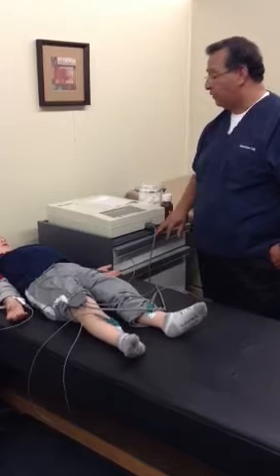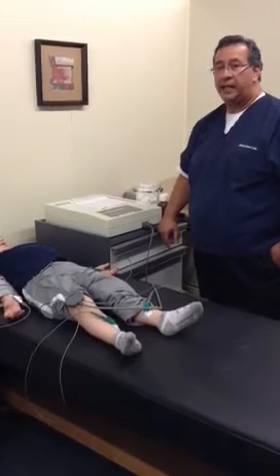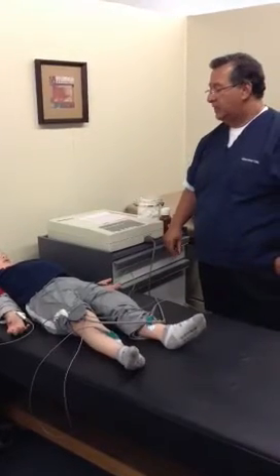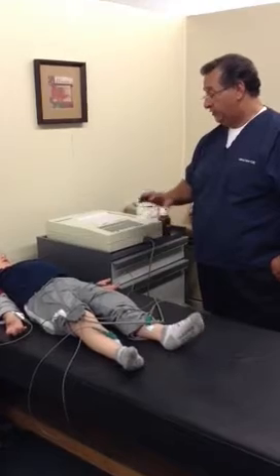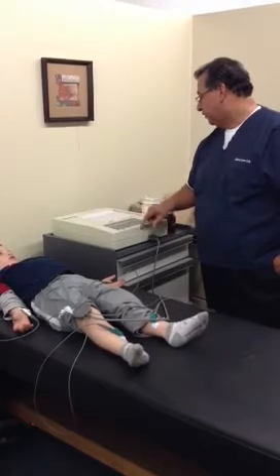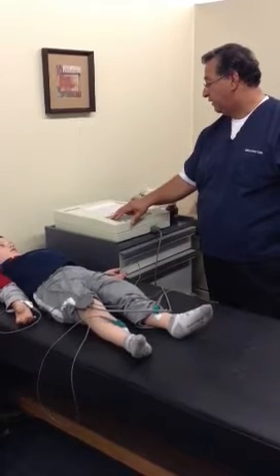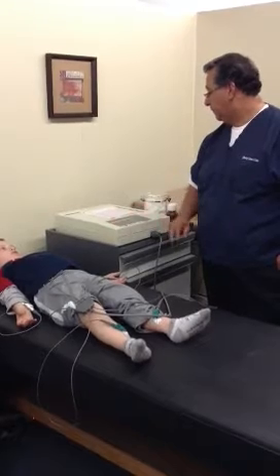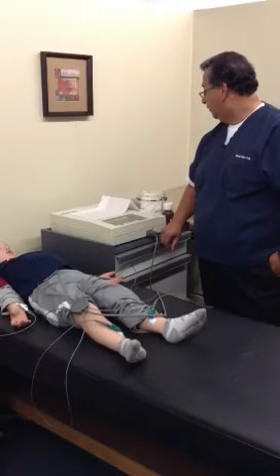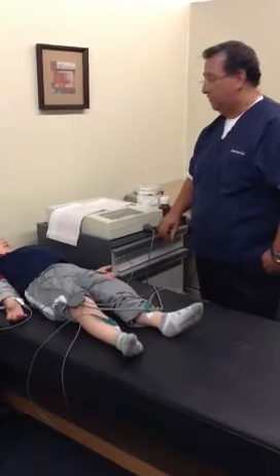You'll see that it starts to record. At this point, we just need to make sure that the patient is fully relaxed. Now I'm going to run it again, but this time because I see there's a little bit of interference — we'll talk about that in class. The patient moved while I was running it, so I just need you to relax and not move until we're done. We're going to run it one more time — hit return and hit auto. Nice and relaxed, don't move. Relax your arms. Close your eyes. Patient is doing really good. Hold still. Don't move your head. You're doing great. Perfect.